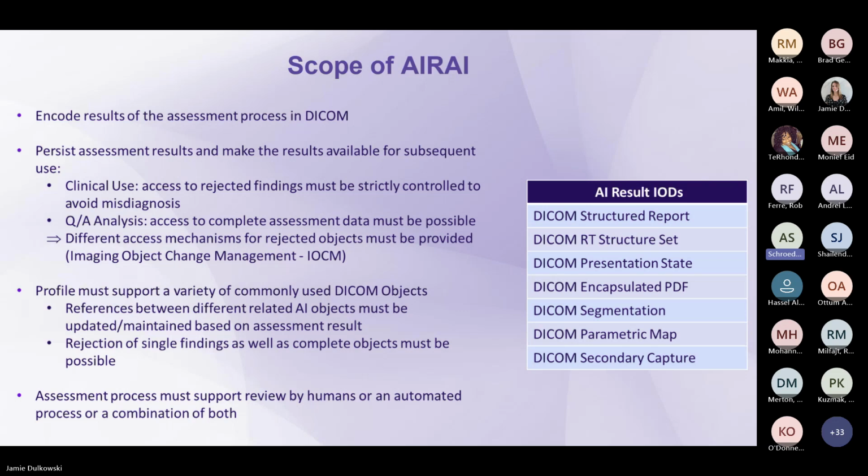So with that, we decided to use the IOCM, the Image Object Change Management means, to manage the access to this information. And also one big assumption that we put in is that we want to deal with multiple AI objects or multiple DICOM IODs that could carry AI information. You can see some of the examples on the right-hand side in the table.